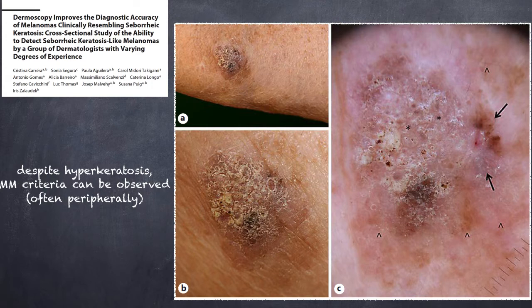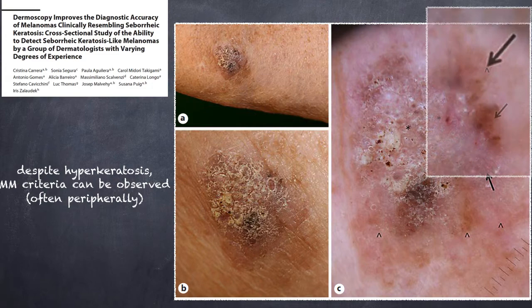Here is another example of a melanoma resembling a seborrheic keratosis: clinically there is a lot of hyperkeratosis, but with the dermatoscope we observe at the periphery the presence of tiny globules and pigmentation that are definitive clues for a melanoma diagnosis. So when you have a hyperkeratotic lesion, use your dermatoscope and check for melanoma-specific criteria — not in the hyperkeratotic area but in the flatter peripheral area of the lesion.